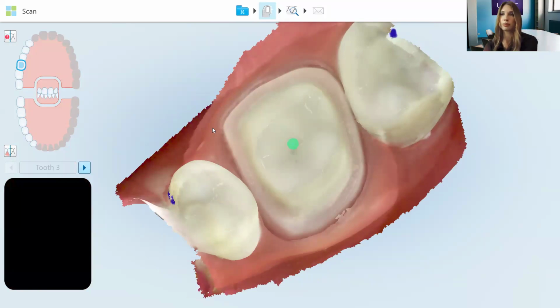So a couple of things, when we talk about prep separation: if you line those green crosshairs up perfectly center on your prep, you double check yourself. Sometimes it's hard to get perfectly center. So then the second step is that green dot. If you are pretty centered and you do those things, when you go to check that prep separation tool, it's usually spot on. You shouldn't really have to adjust anything. So just a little hint there.